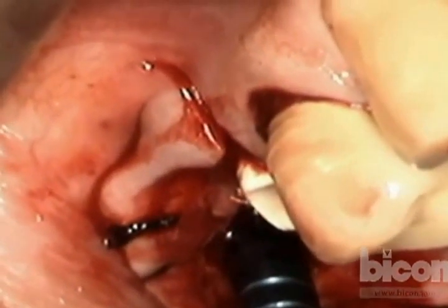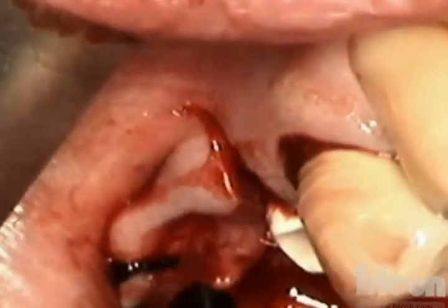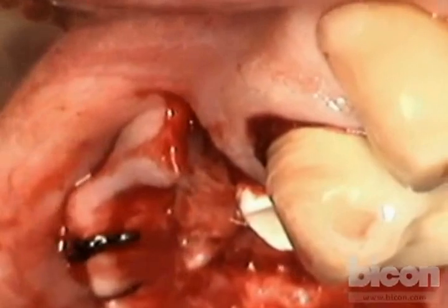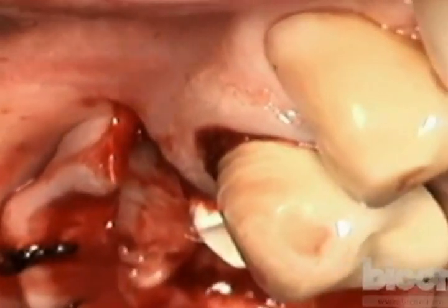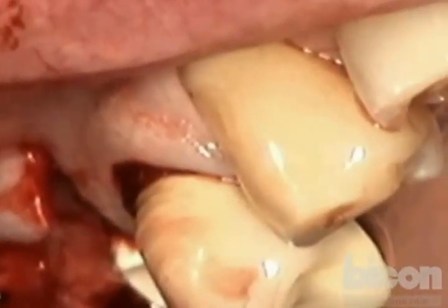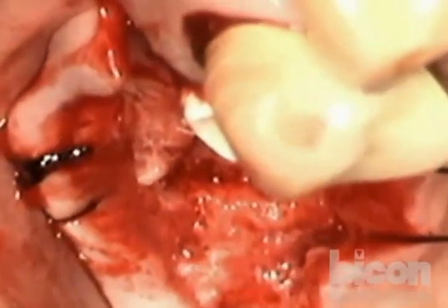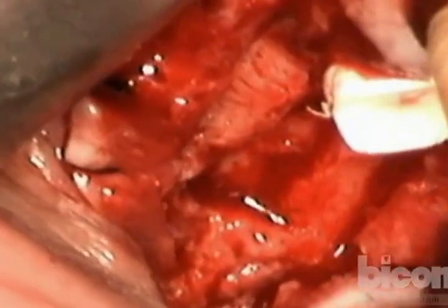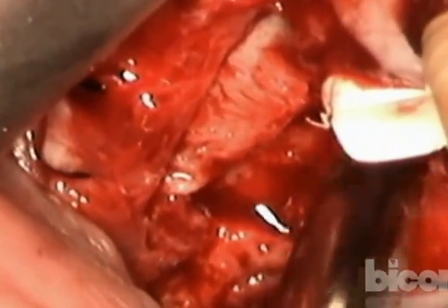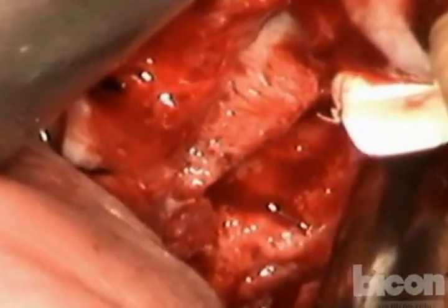However, you still have to be very careful because as you're lifting it up, the sinus mucosal lining has to give. So as you see, I stopped to talk to you, but even if I weren't talking to you, I'd be stopping because we want to allow the sinus mucosa to swell and lift itself up slowly. A key to this technique is to be patient. So as you can see, the rectangle has now mobilized, it's telescoped in. Okay, it's very nice, healthy bone.